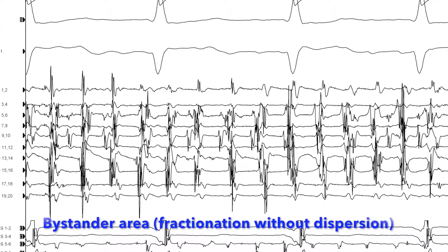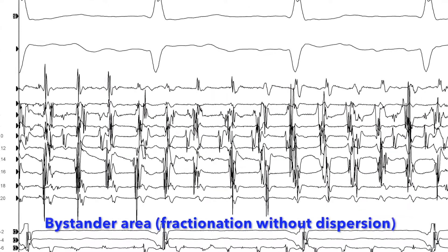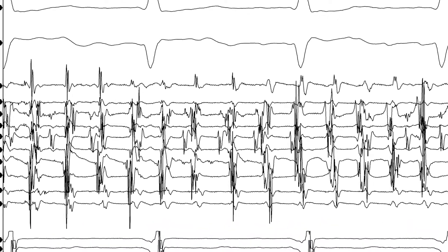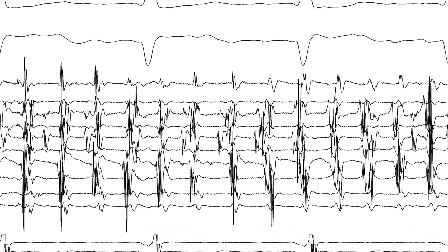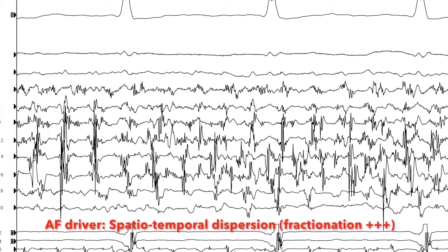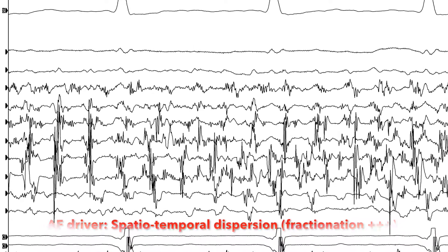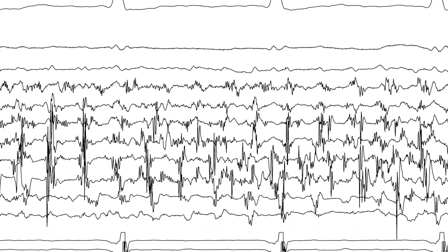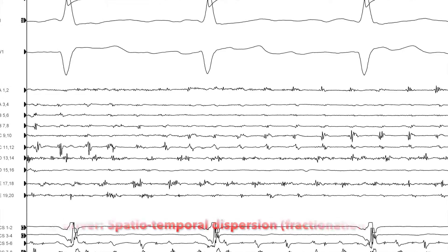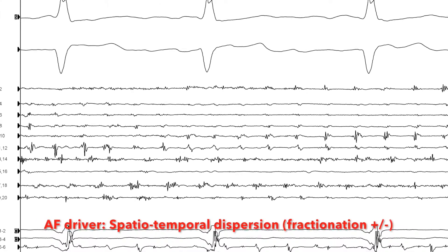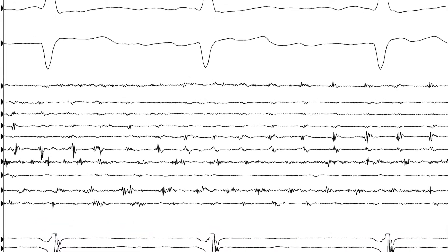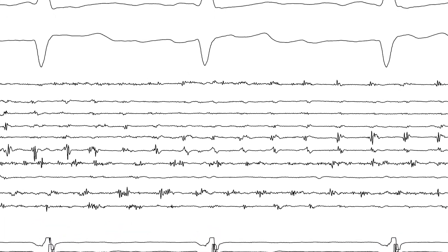Here is an example of a bystander area without dispersion with a low degree of fractionation. This is an AFib driver with dispersion and a high degree of fractionation. This is another AFib driver with dispersion and a low degree of fractionation.